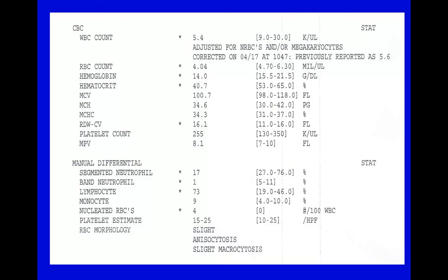But what we could do is default to the normal reaction of the body. If your body has infection or inflammation, what should your body do? It should release white blood cells. So we're going to say, and if you look at the section on relative and absolute, we're going to interpret this as the lymphocyte count elevated, and because of that, the neutrophil count appears to be decreased.